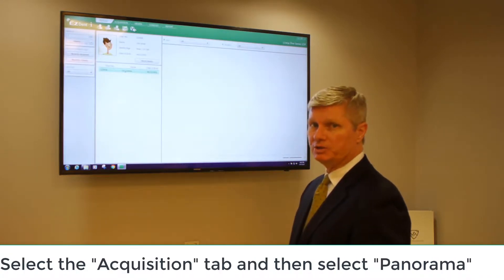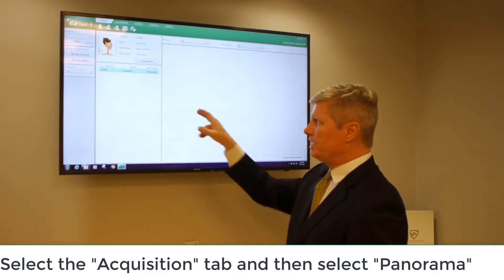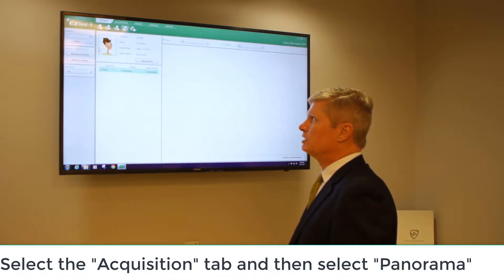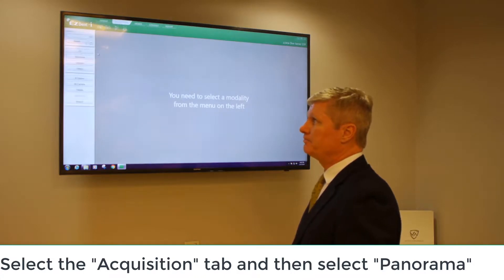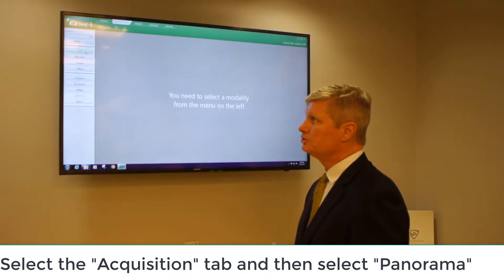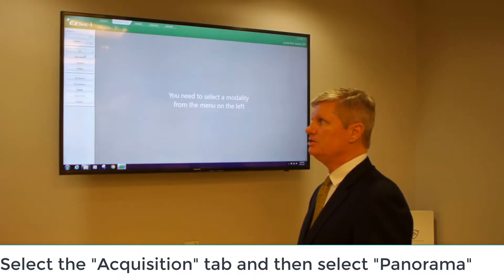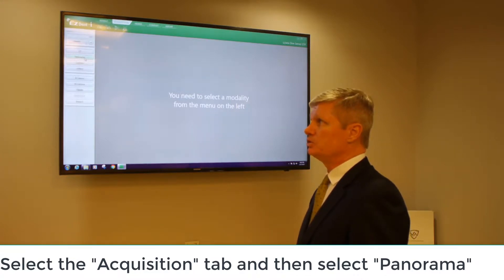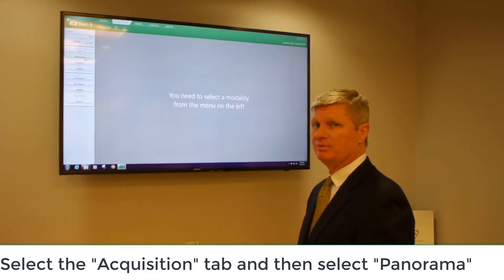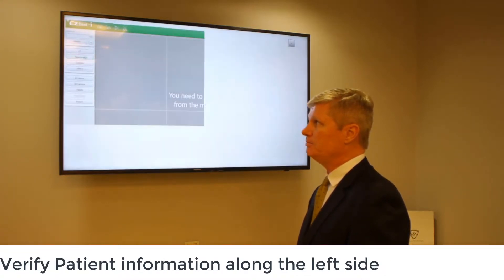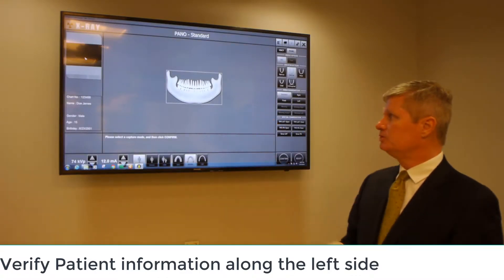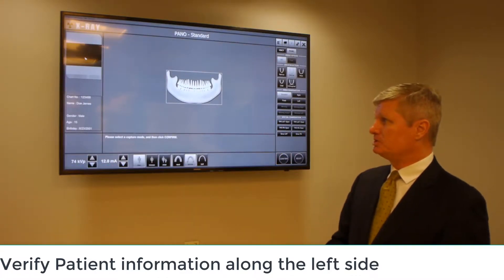Now that we have our patient added to our database, we can now capture an image on James Doe. We'll click on the Acquisition tab here at the top of the screen, and then from here choose our modality — whether it be CT, Panorama, or Cephalo. In this case we're going to do a Panorama, so left click here on Panorama.